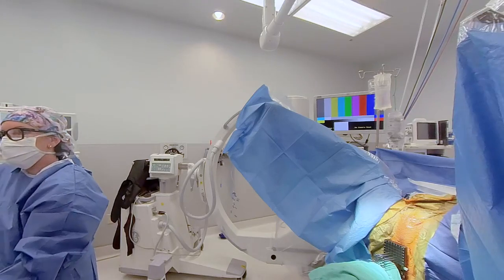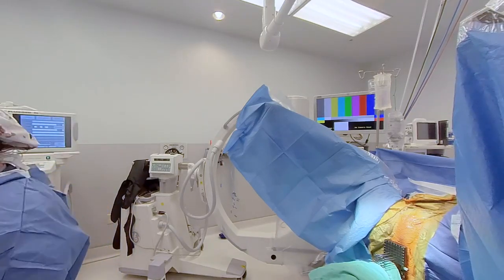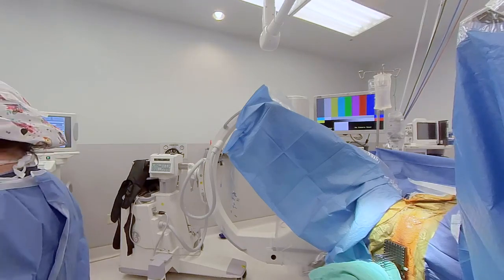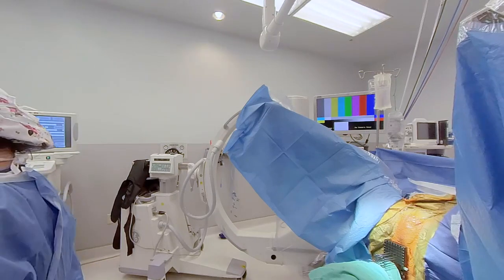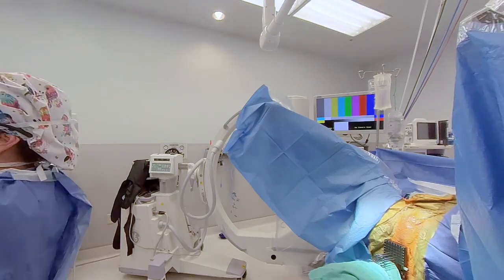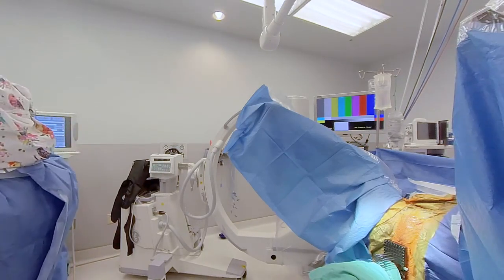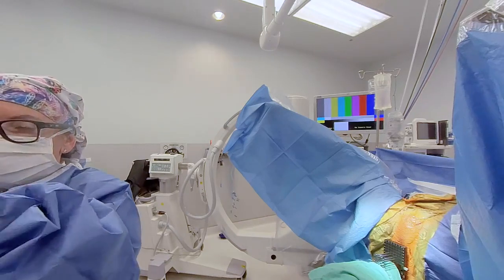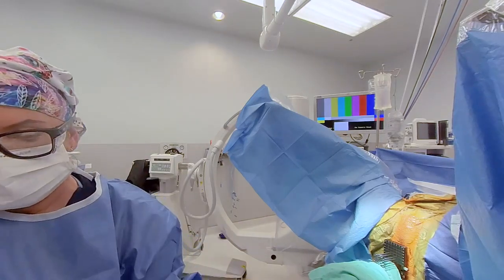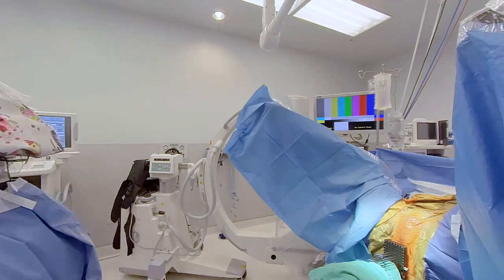The plan takes less than 3 seconds. You can modify it a little bit. As you're looking at the plan, can you take us through what you're looking for, some of the key metrics that you'd like to use? So, obviously, I re-reviewed the prostate volume, and we look at the needle positions in real time in the implant view.